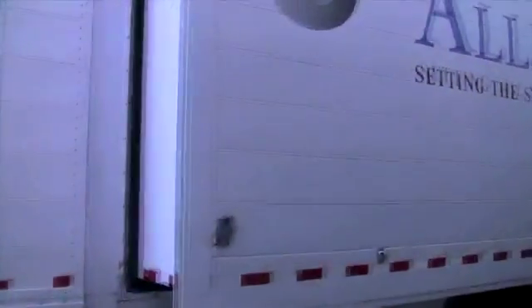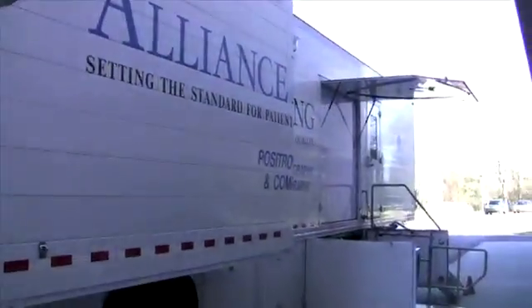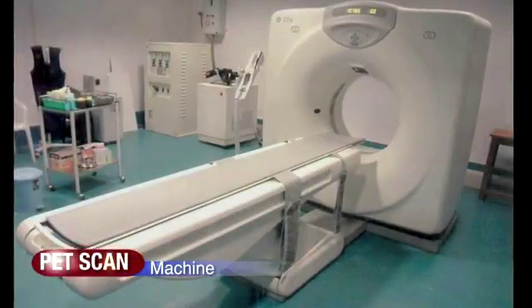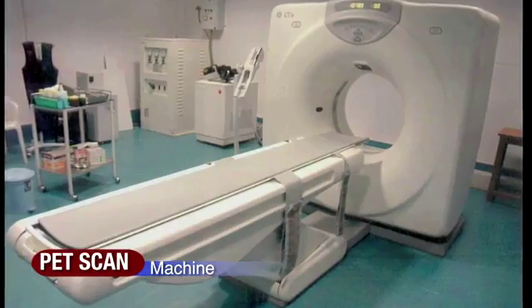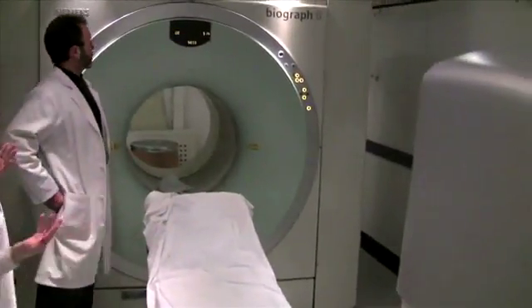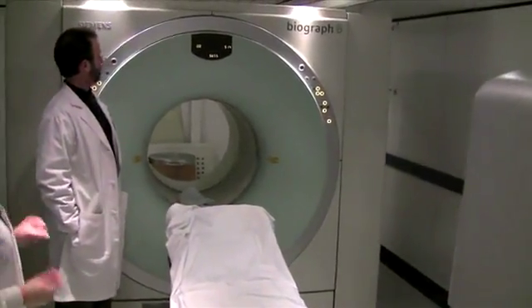We will frequently recommend PET scan in order to evaluate nearly the entire body. The PET scan is not really ideal at picking up on malignant changes in the brain, but it does a very good job from the base of the skull down through about the mid-thigh. It's a nuclear medicine scan, and so it is done in the radiology department. The machine itself looks a lot like a CT scanner, just a little bit more width on the donut-shaped hole that the patient has to go through.